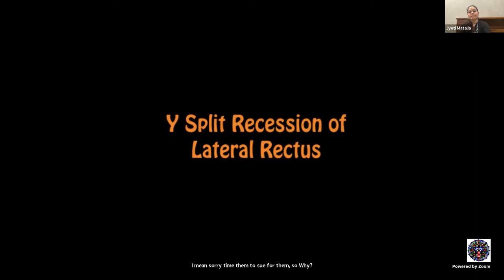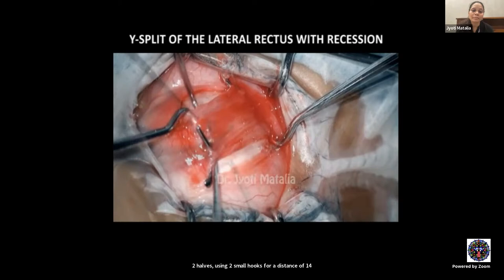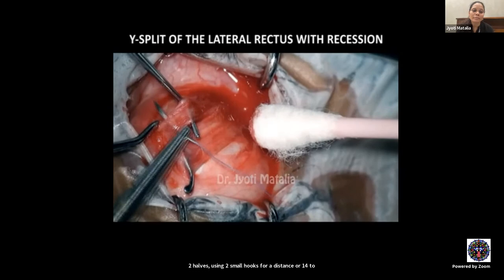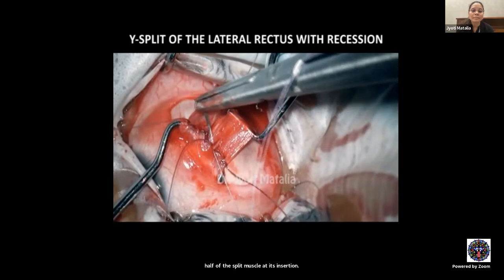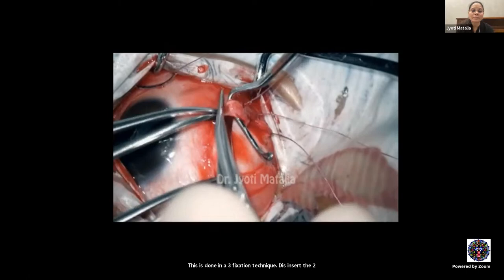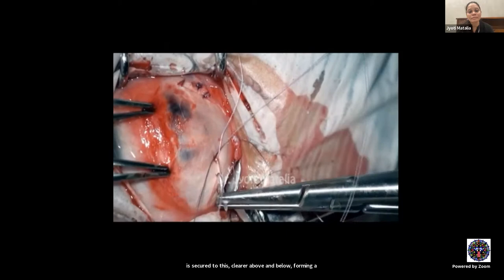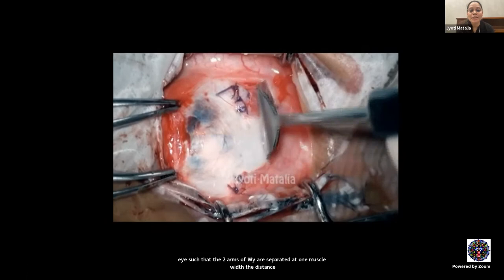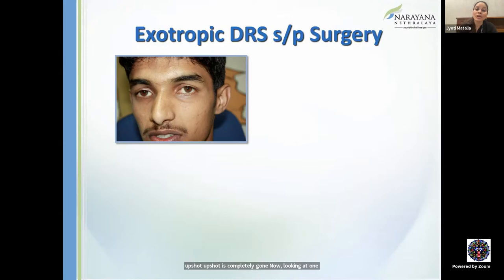Surgical video of Y-split with recession: isolate and expose the lateral rectus, split it into two halves for 14–16 mm from insertion using two small hooks. Place 6-0 Vicryl in a three-fixation technique on both upper and lower halves at insertion and disinsert them. For 6 mm recession with markings, each half is secured to the sclera above and below forming a Y, separated by at least one muscle width (now preferably 20 mm/two-width technique). Post-operatively upshoot was completely eliminated with limitation of adduction reduced to about minus one.